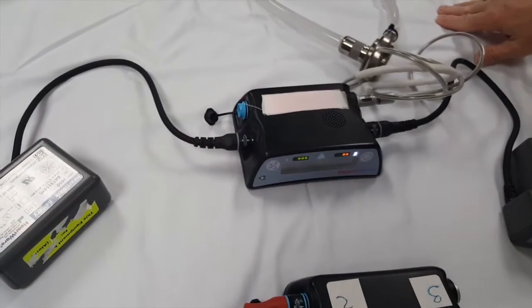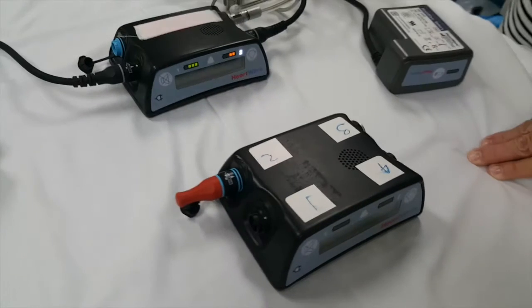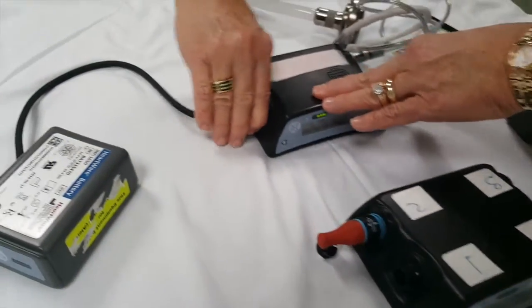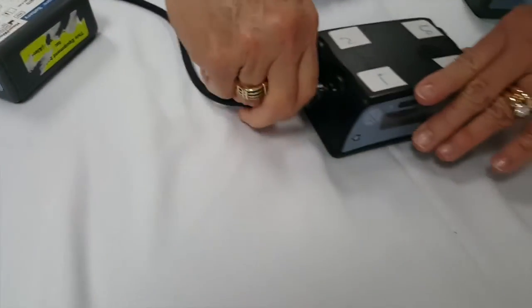The steps to changing the control box should be followed in order. Make sure you have all your equipment lined up and ready. The patient's VAD will temporarily shut off when you switch control boxes, so you want to do this as quickly as possible. First, connect the new control box to one of the batteries.